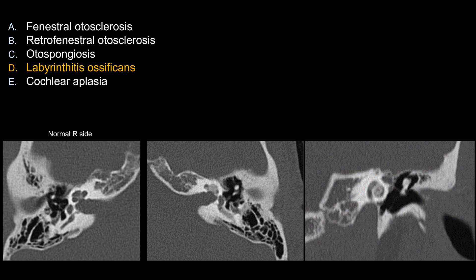For cochlear aplasia, sometimes the cochlea would not develop, so you see the entire thing is wiped out. Here you can still see the cochlea — it is formed but abnormally dense inside — so this is not cochlear aplasia. Another way to tell the difference between cochlear aplasia and severe labyrinthitis ossificans is that you should see formation of the cochlear promontory in labyrinthitis ossificans, whereas in cochlear aplasia you often don't see a properly formed cochlear promontory.